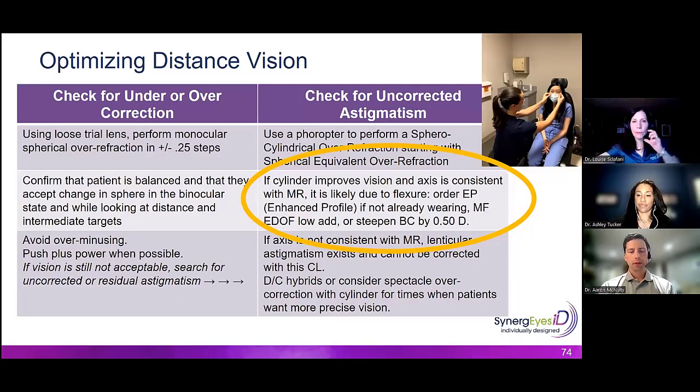We kind of sped past that slide that you referenced, Louise. In the first several thousand fits, there was an algorithm change for maybe a little bit steeper base curve approach on a lot of patients. That's made a nice positive improvement for me. So if there's anybody who tried ID or heard about ID, that algorithm tweak has made a noticeable improvement in the outcomes since the early days.